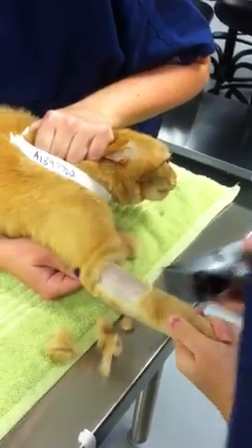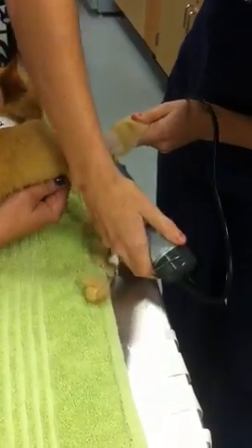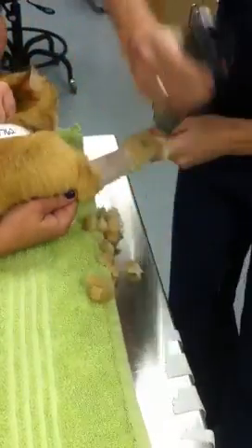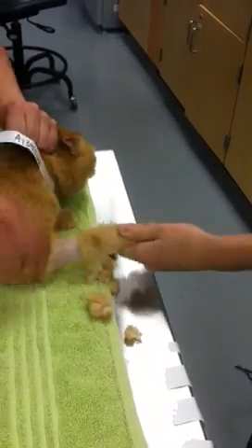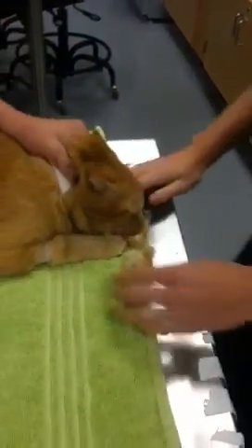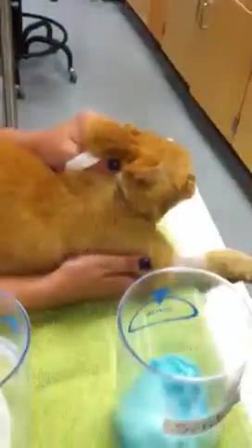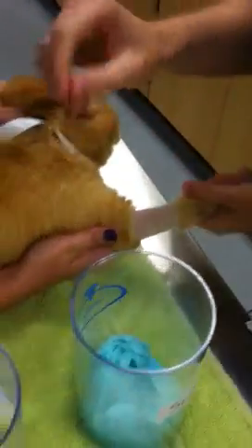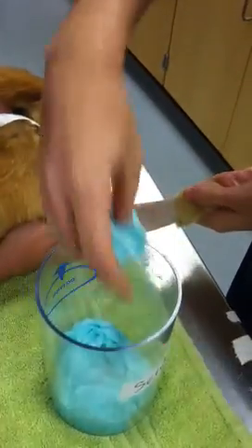Now that we have a good portion shaved, we're going to get some of this fur out of the way and we're going to scrub the site so it is sterile, starting off with a chlorhex scrub.